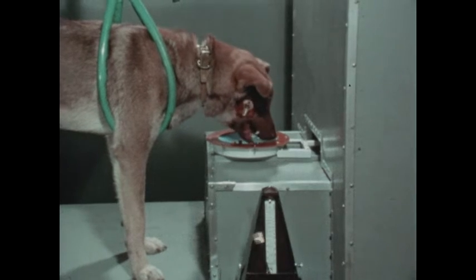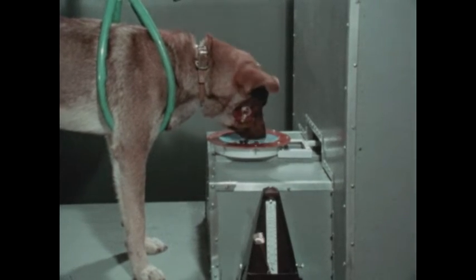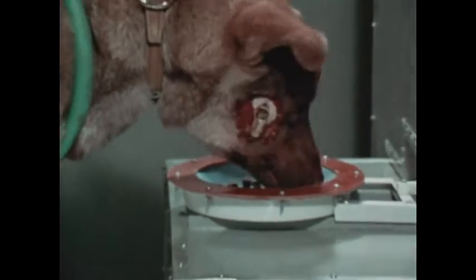In this first trial, there seems to be no change in the reflex. Saliva is secreted when the dog starts to eat. We'll repeat the same procedure several times.